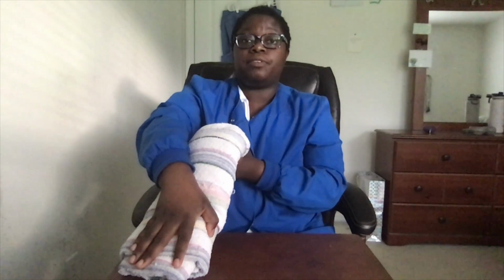Lastly, for the ventral gluteal, once again, you need to go to the patient's leg, but this time it is going to be opposite. So if you're using the patient's left leg, you're going to use your right hand. Once again, find the patient's trochanter, but now place your palm on top of it. Your thumb is going to be pointed towards their groin, and your index is going to be on their anterior superior iliac crest. Move your middle finger and the other fingers towards the patient's buttocks. The area in between my index and my middle finger is where you'd give the vaccine.